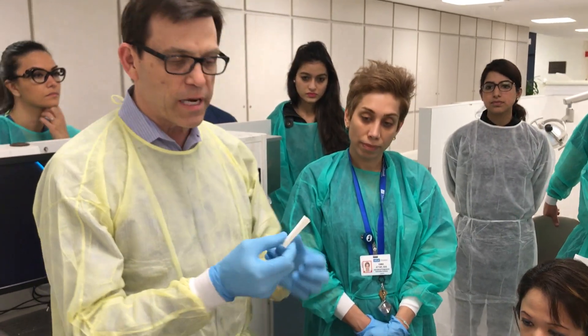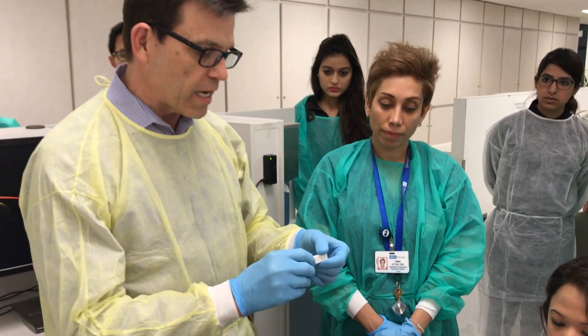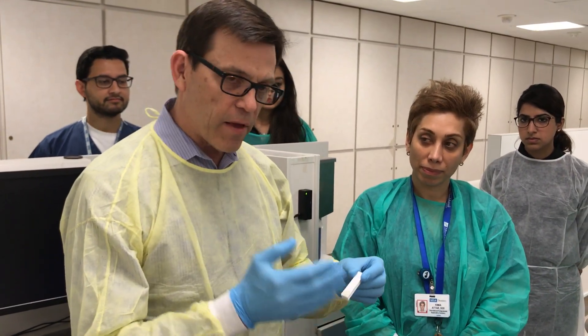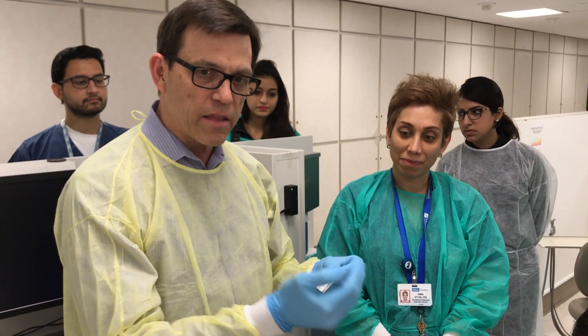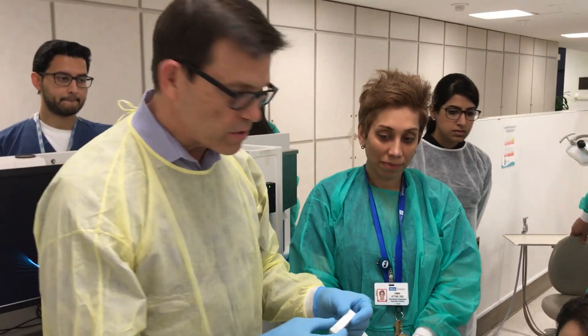That requires doing some deprogramming or maybe some training of the patient when we get the bite. So I'm going to start with the entire stack of leaves. I always like to start with the entire stack just as a starting point and to get the patient to understand what it feels like to have their front teeth touched before their back teeth, which they may not feel that often. That'll be the first step that we do.